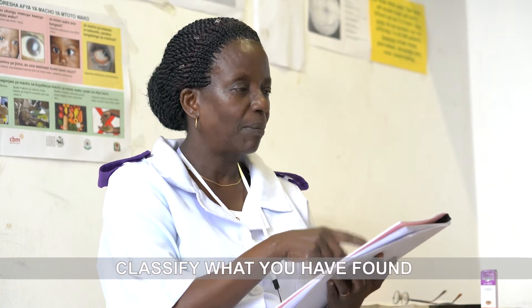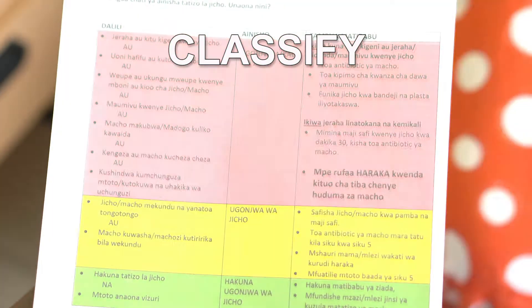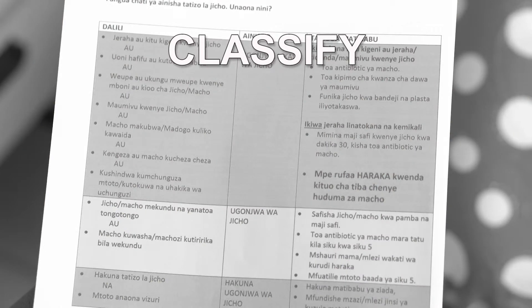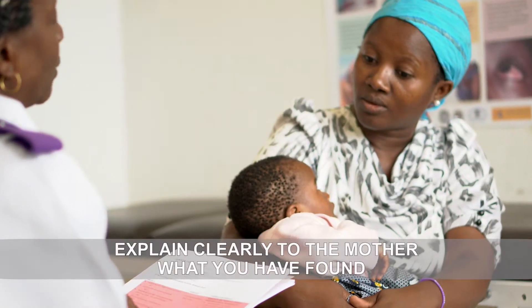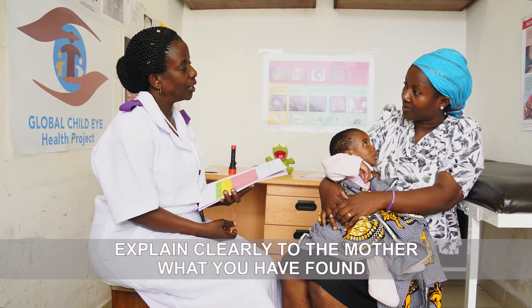Once you have finished, classify what you have found according to the chart booklet. Remember to explain clearly to the mother what you have found and if there is anything she needs to do next.